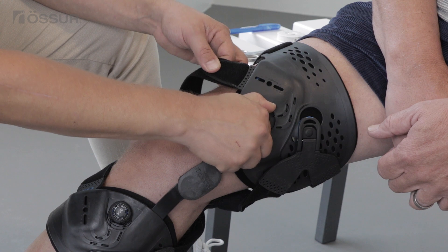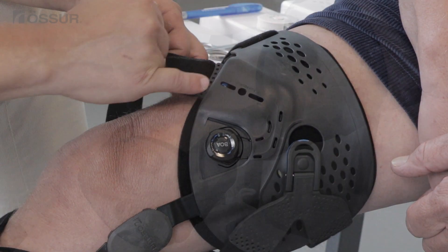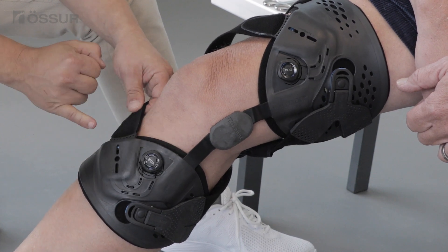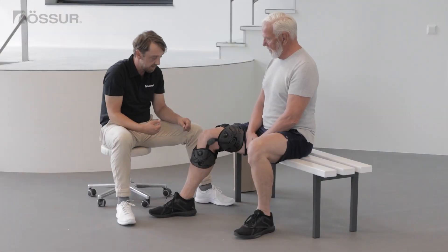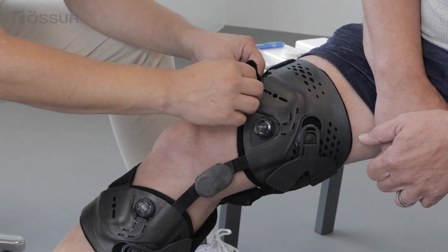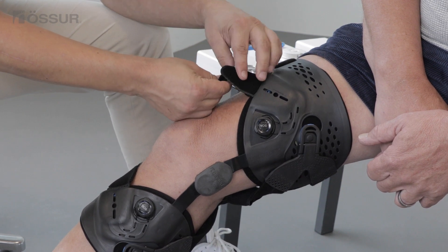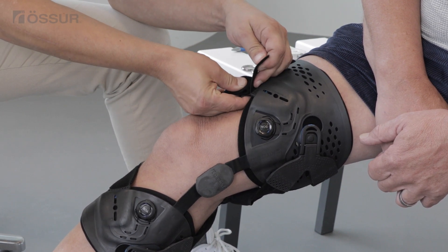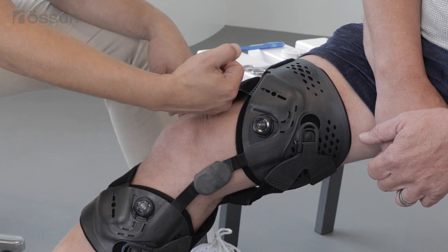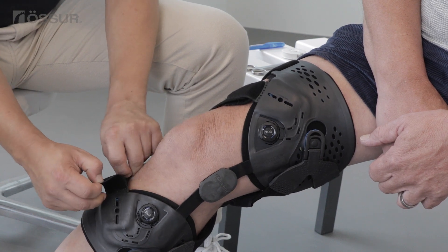Turn both smart dosing dials clockwise until the blue indicators are at the lowest setting. With the leg fully extended, adjust the upper dynamic force system strap length using the alligator clip. The strap should be firmly in contact with the skin without providing unloading force. Adjust the lower dynamic force strap length using the alligator clip as before.